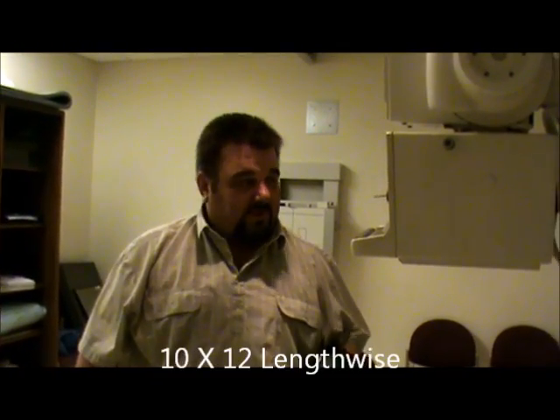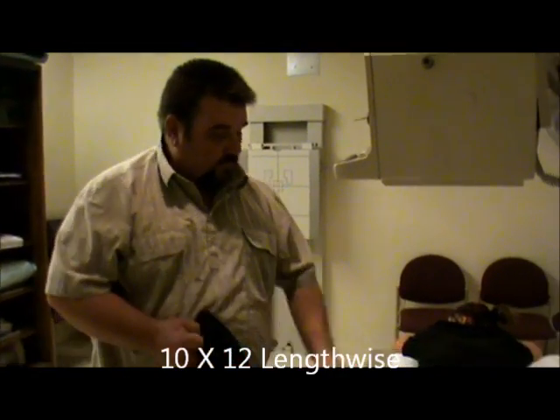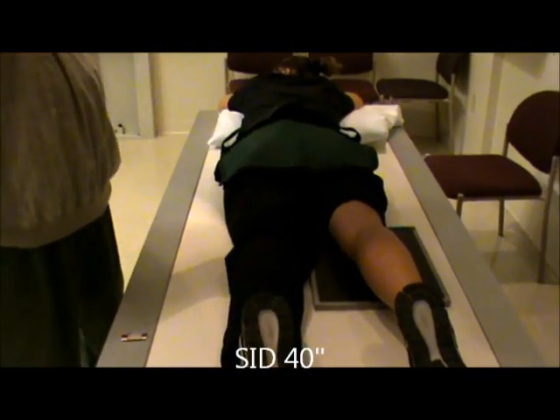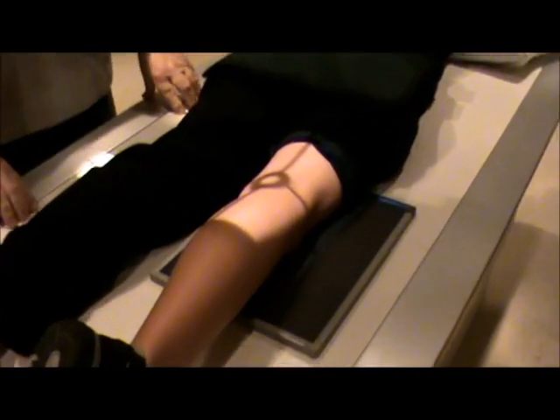The film size will be 10 by 12, lengthwise. We're going to be using a 40 inch SID. We're going to have the patient laying prone on the table, and we're going to lay the shoulder across them. We are then going to center to the popliteal crease.